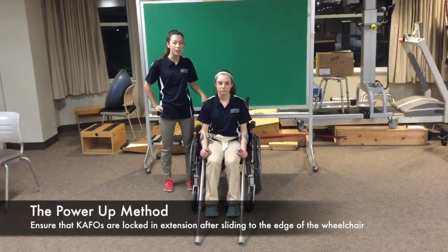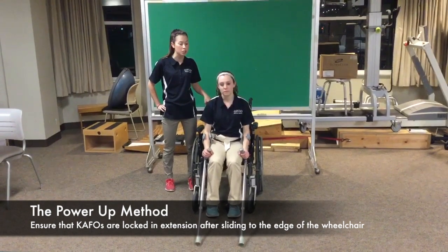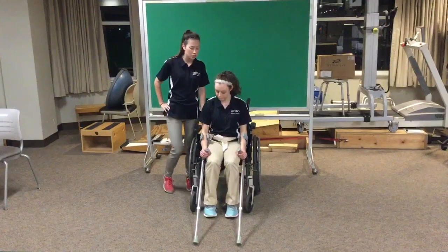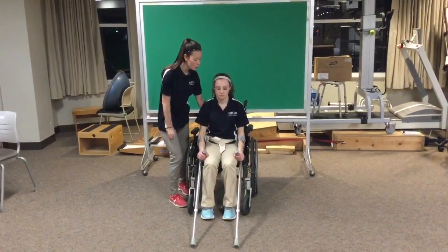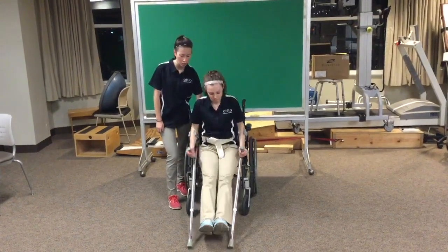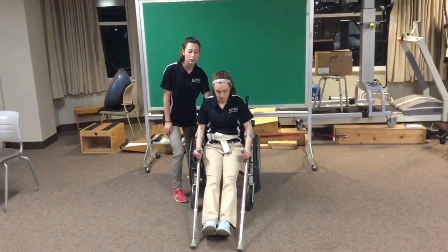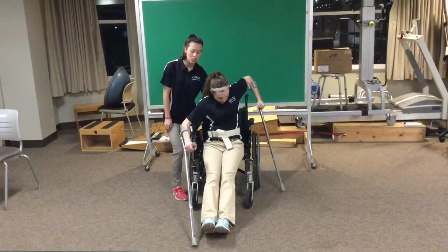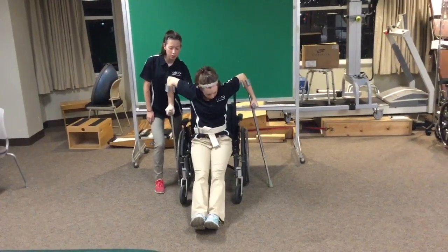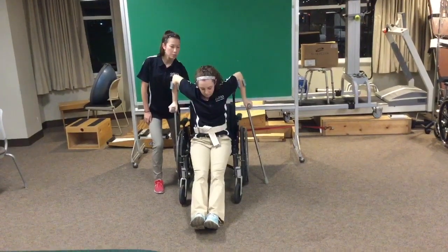This is the power-up method. You're only going to use this method for people with a lot of upper body strength, as this is a more challenging position. You're going to begin again with the wheelchair locked, and place the gait belt around the patient and hold onto the gait belt at all times. Next, have the patient scoot forward in the wheelchair so their body is at the edge of the seat. Then have the patient reposition the crutches so that their shoulders are in extension. The patient is now going to place all their weight through the grips to stand up, maintaining the C shape in their spine.